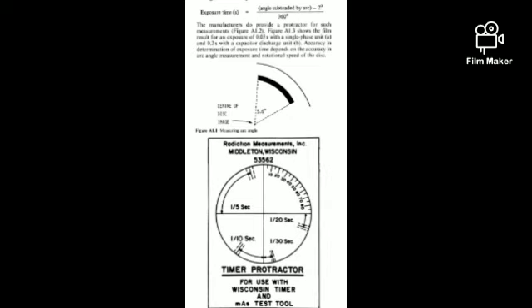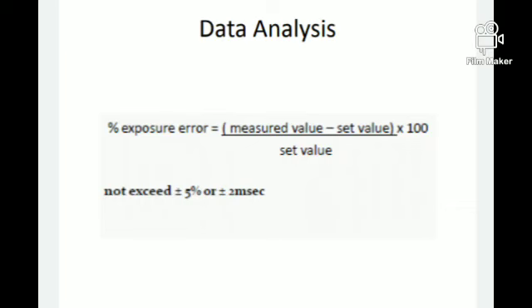Now everything is motorized. We put the timer checker and find the number of density patterns on the film. In the image it is mentioned how many seconds each rotation requires, based on pulse frequency. If it is a single pulse, it will be 1 by 50. If we are using a full wave rectifier, then it will be 1 by 100, and so on, and we do the calculation. Our degree of angulation, if we are using an arc, is 360 degrees. Keep that in mind.